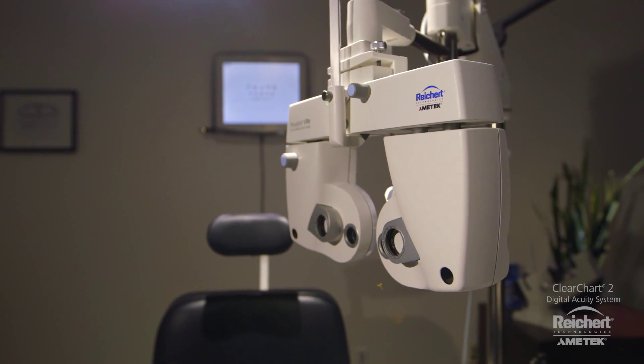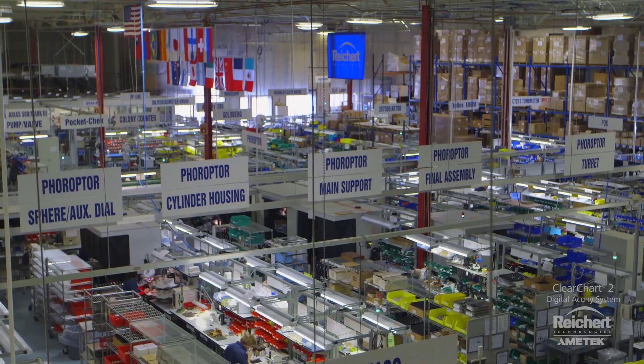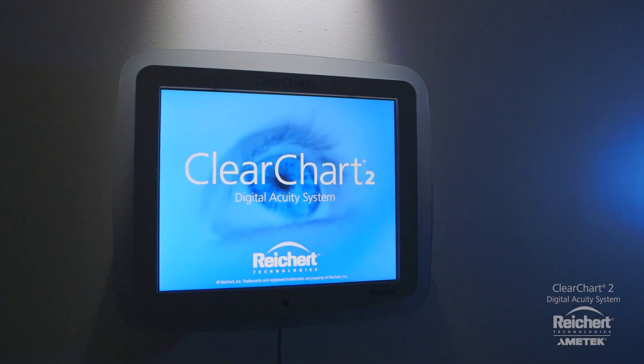ClearChart 2 is built on a legacy of innovation in acuity and refraction and is proudly made in the USA at our state-of-the-art world headquarters in Buffalo, New York. ClearChart 2 digital acuity system from Riker Technologies.